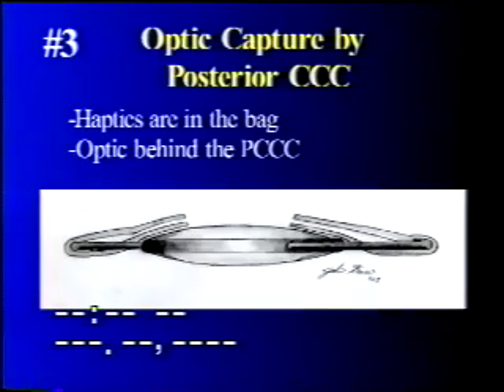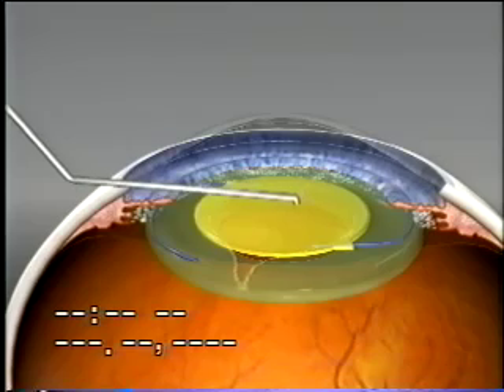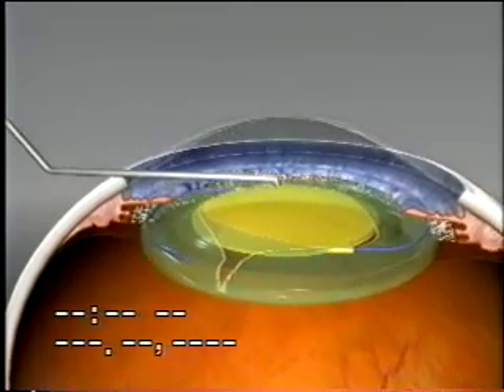The third option is optic capture by the posterior CCC. In this case the lens is put in the bag, and then through an intact posterior capsulorexis opening the optic is pushed through that opening to be captured by the posterior CCC. We've utilized this for many years in pediatric surgery to avoid secondary cataract formation or opacification of the visual axis by Elschnig pearls being deposited on the vitreous face.